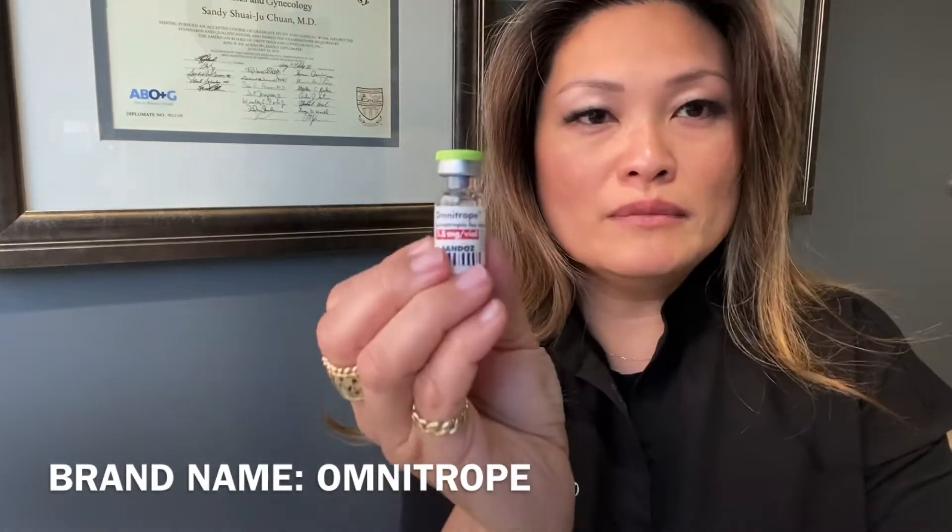In this video, I'm going to be teaching you how to use your growth hormone, which is prescribed as part of your IVF treatment protocol. Growth hormone usually comes in bio form, and the brand name is called Omnitrope.